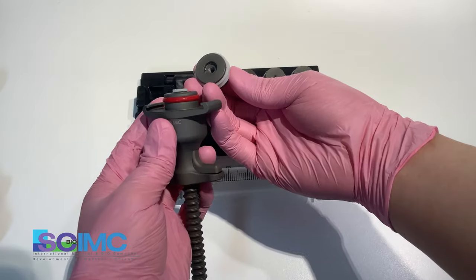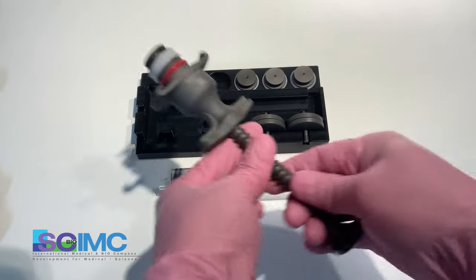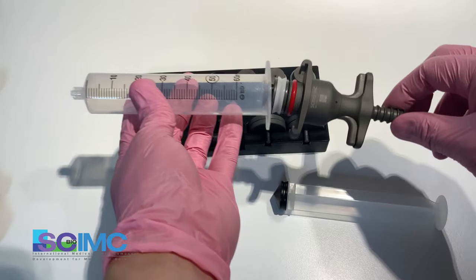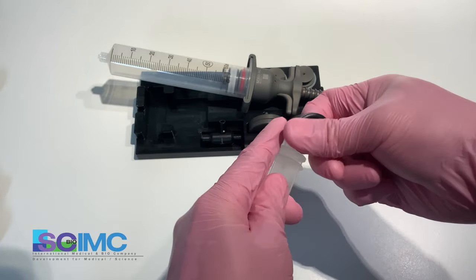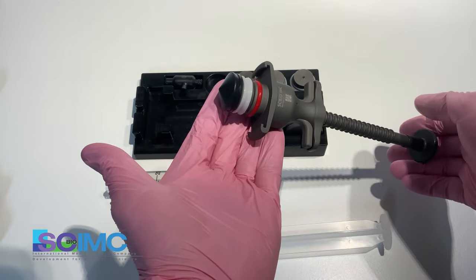The device needs to connect with the piston. Remove the plunger and connect the syringe to the device. Also, you can put the plunger in front of the device — like this.